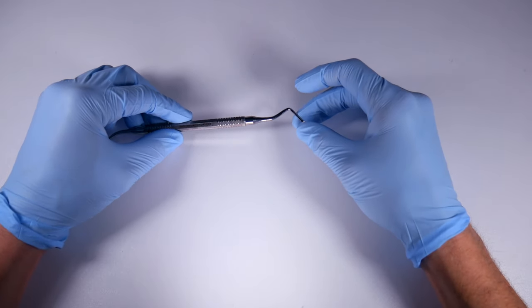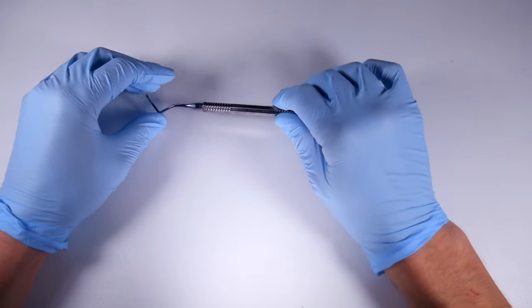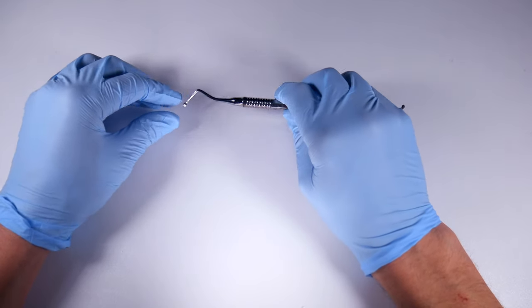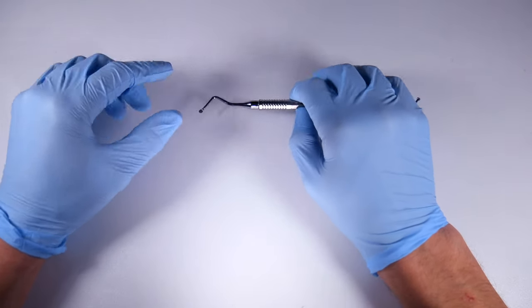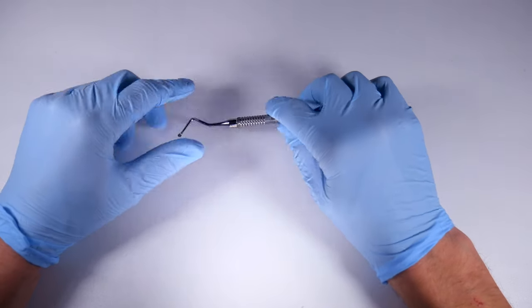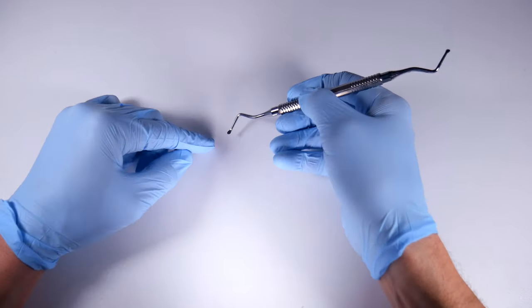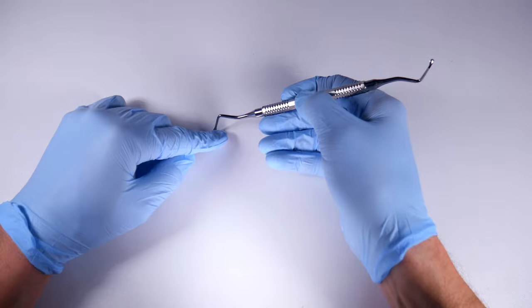It's a serrated curette. It's a little bit more aggressive, and it's terrific for lower third molar sites. You can actually take this and get in sort of right distal lingual to that second molar once the tooth is out.